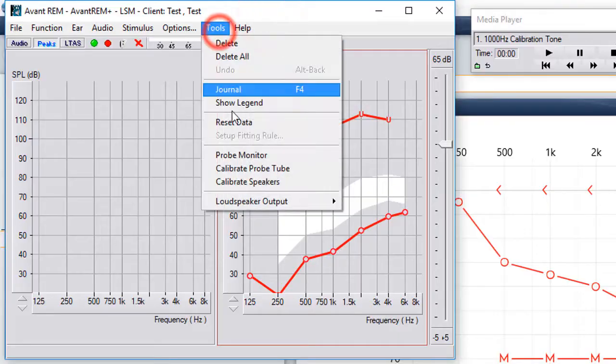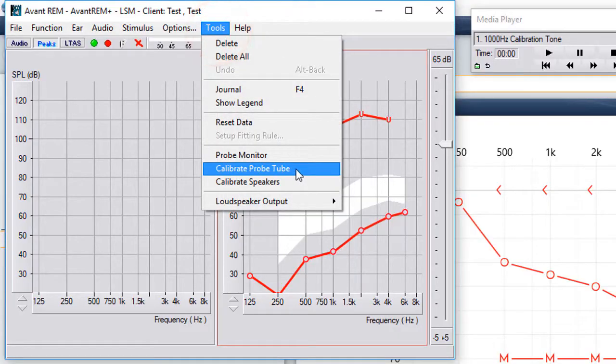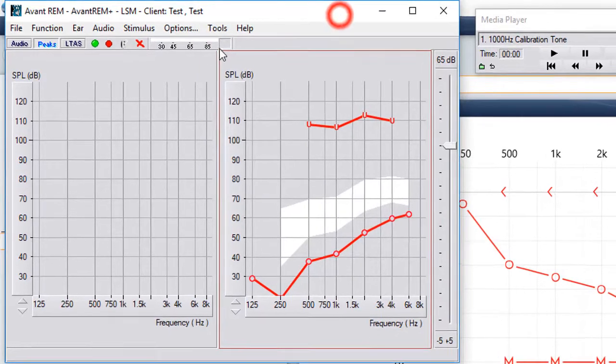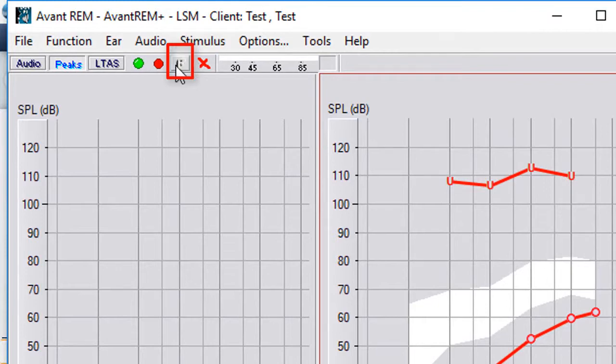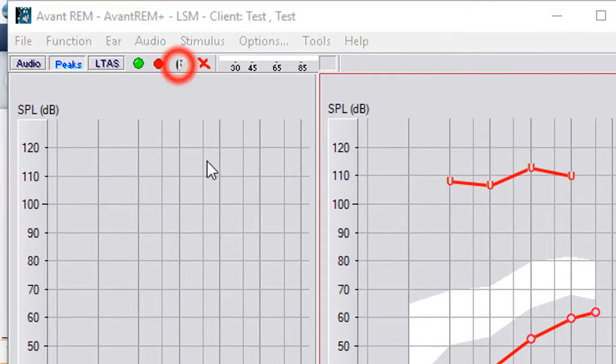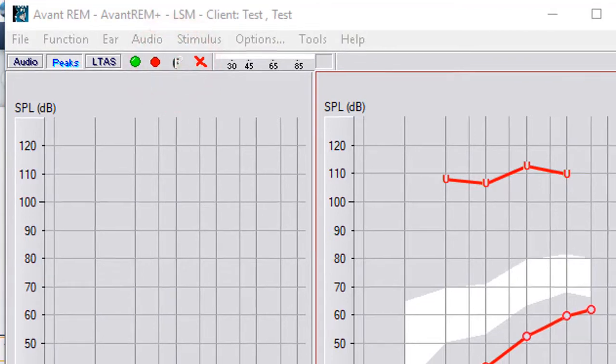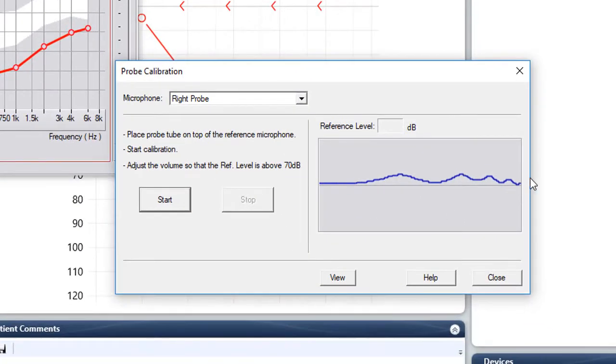Now we're going to go back to tools, calibrate probe tube. Or there's actually a hot button right here that you can click on and it's going to pull up your probe calibration.